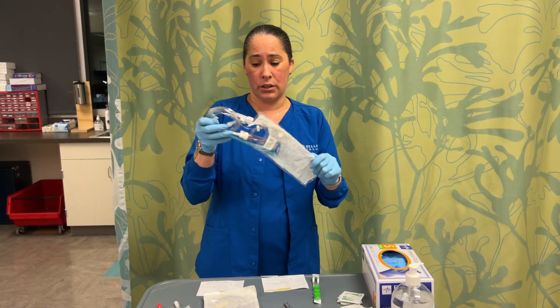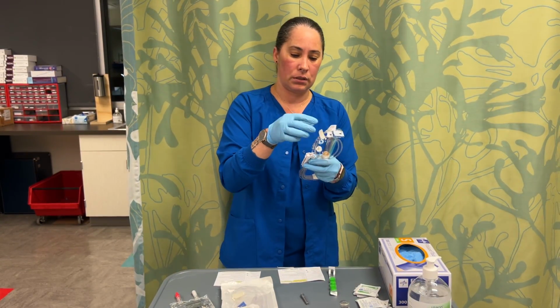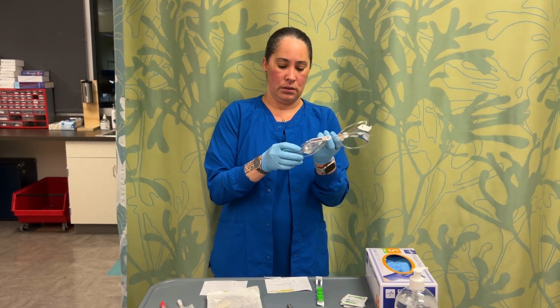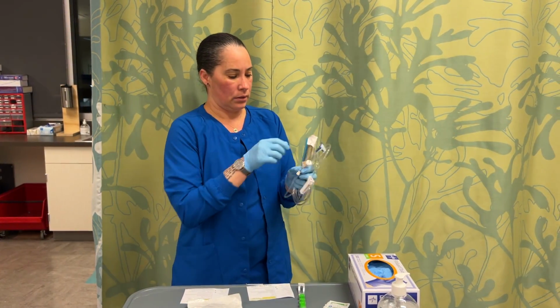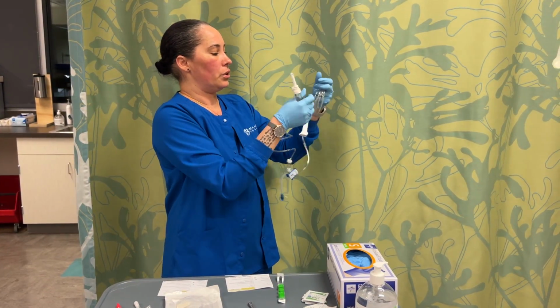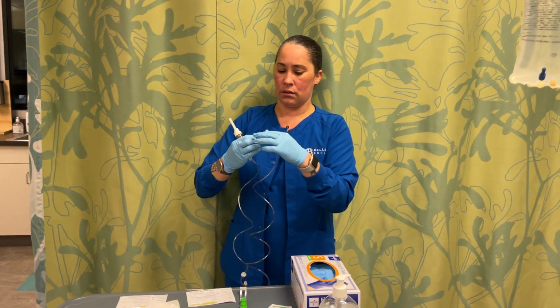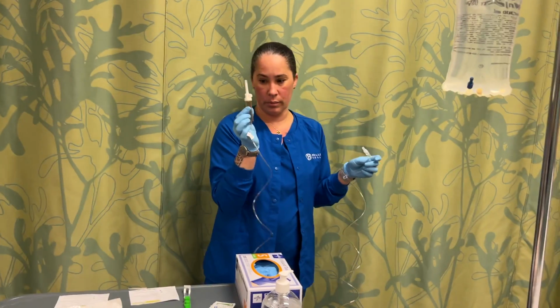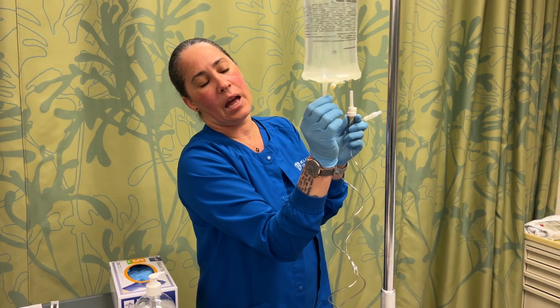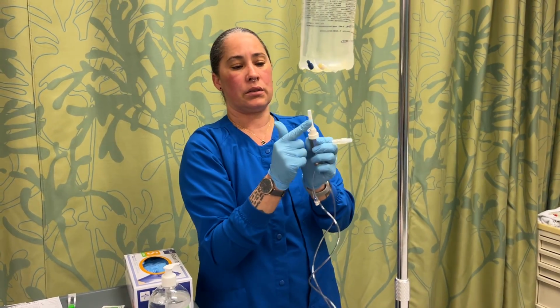And you're going to make sure to keep all of this away from anything. You want everything as sterile as possible. You can take all the little papers off. So you'll have your two ends here. This end is for the patient, and this is for your bag. So these bags come with a little cap, basically, and you have to puncture this for the fluid to come out, and that's what this is.